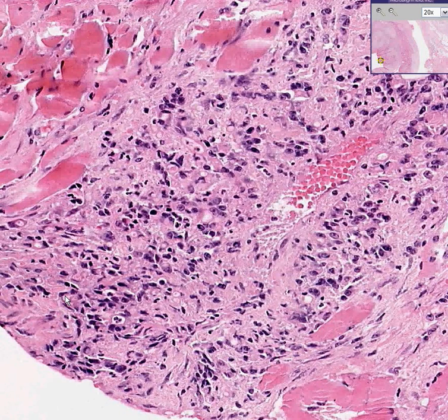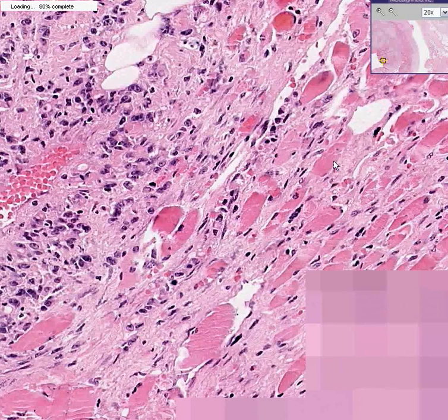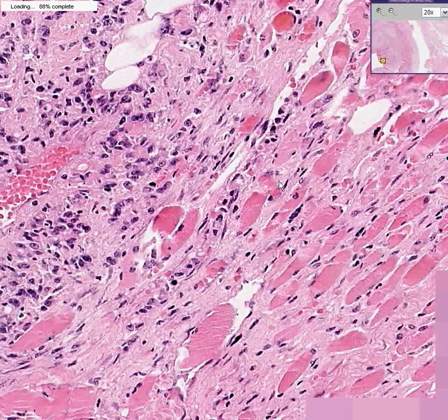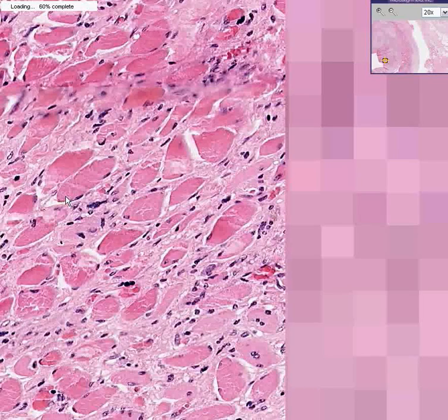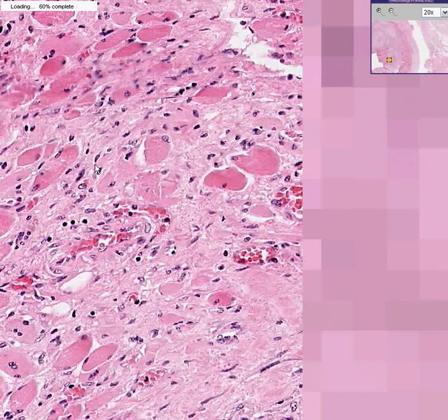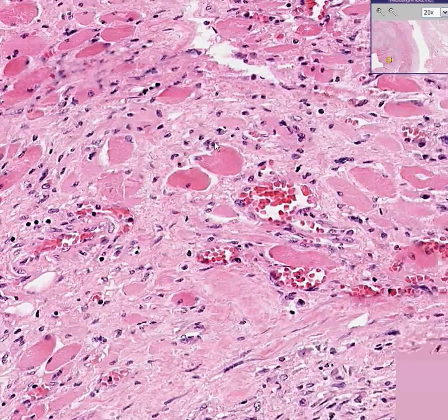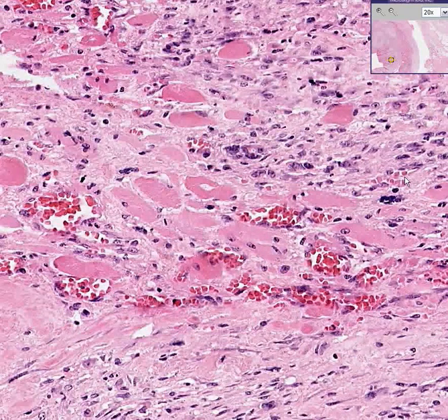So let's travel all the way throughout the thickness of this leather bottle stomach and find some more diffuse tumor. This could very easily be some over here, but I'd rather not bet my life on it. Here's some tumor nests over here, here, here, here. And notice not only is there a significant amount of true dense fibrosis associated with these tumor nests, but the whole histology of the stomach is very subtly disrupted.